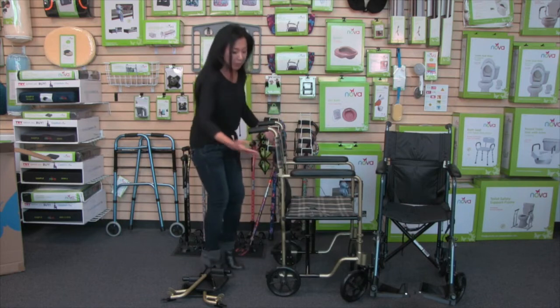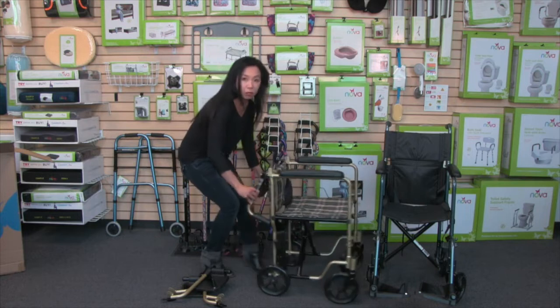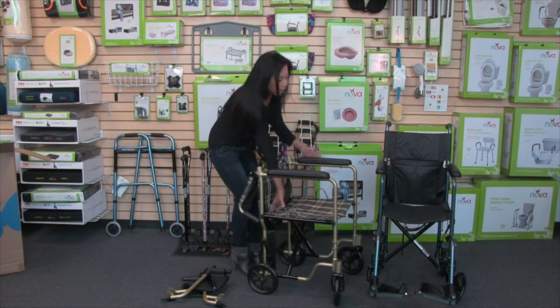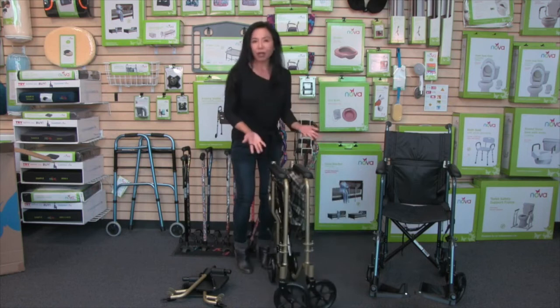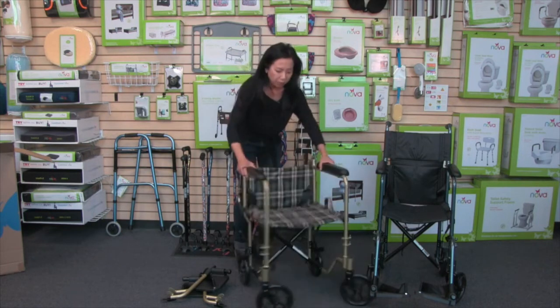To fold it back down, pull in on these tabs — that's how the arms go down, and that's the first step to folding it. Then just pull up on the upholstery, and now you've got it back into the folded position. So easy to fold and unfold.